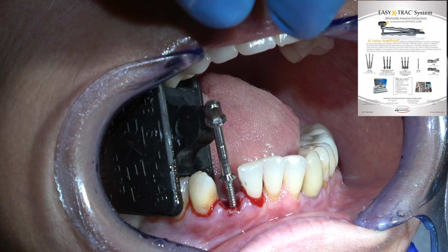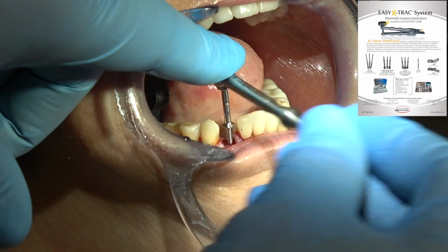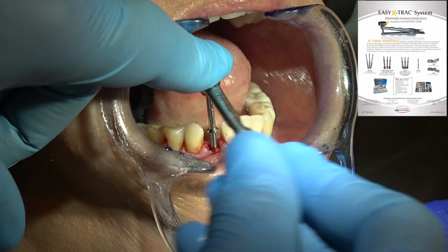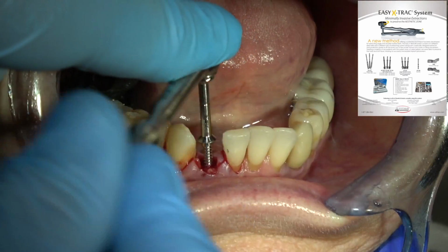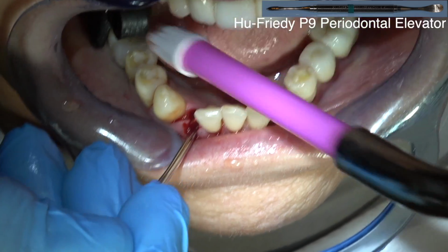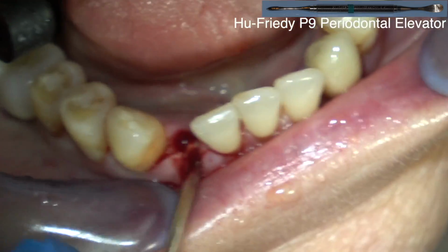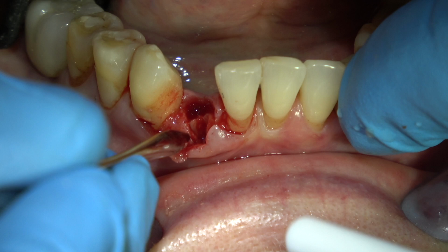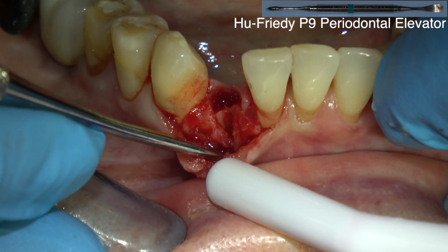So this doesn't work. So I'm showing you real dentistry in a real office. And I go through the same things you go through. You just never give up. You've got to get the tooth out. But sometimes it can be complicated. So I'm reflecting a flap to see what's going on on the facial of the tooth.